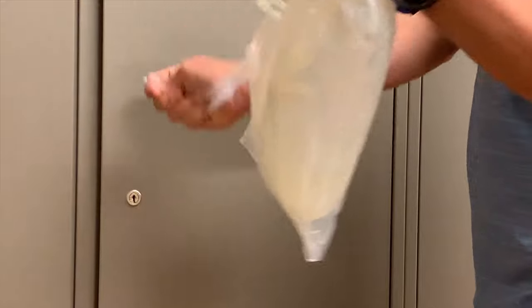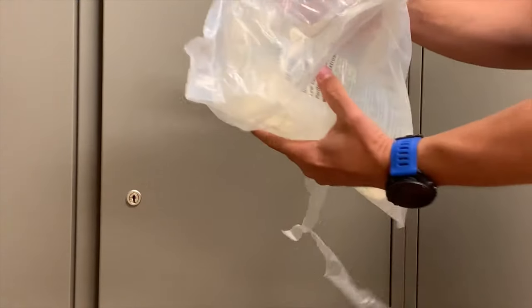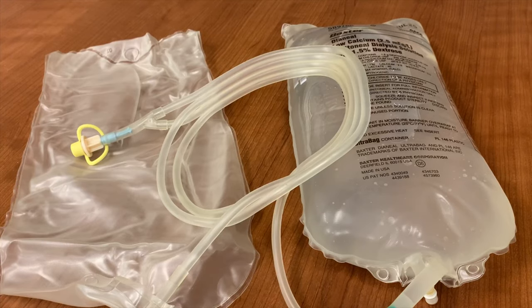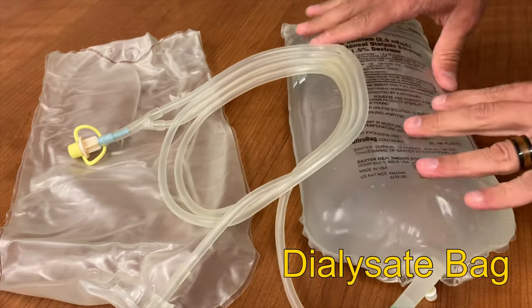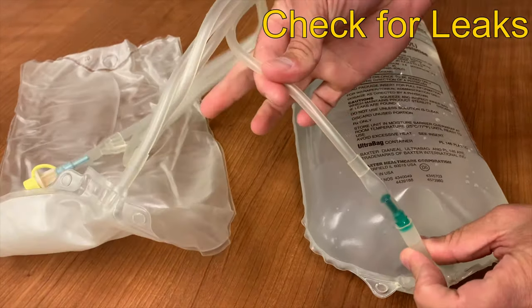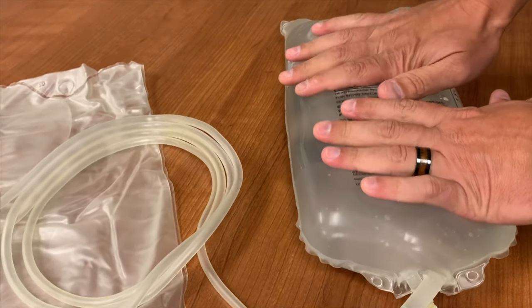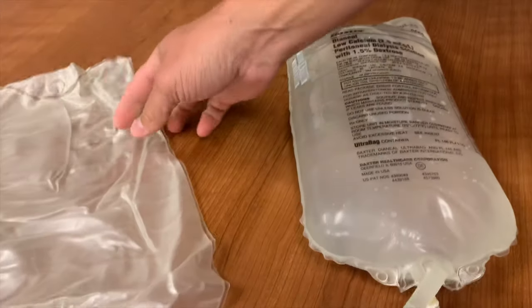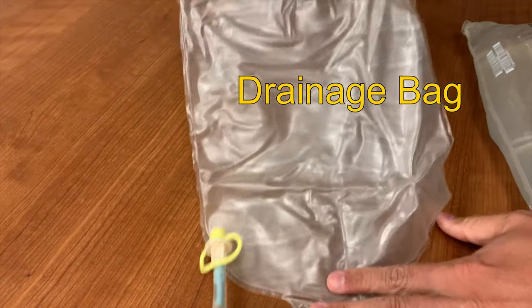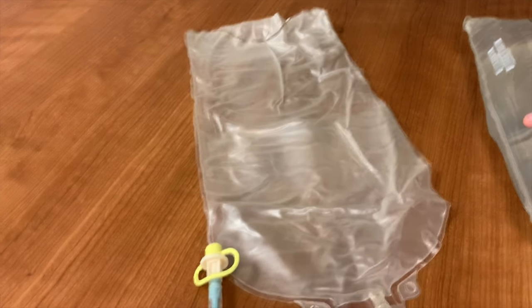Now you can open the UltraBag system. You'll notice that it includes more than just the bag of dialysate — there's also a drainage bag, and all of the tubing is already attached. Now we need to inspect the integrity of the system. Begin with the dialysate bag: squeeze it and check for any leaks. Look in the tubing to make sure that no fluid has entered the tubing, and check around the outside of the bag for any leaking fluid. Now check the empty bag, known as the drainage bag. There should be no fluid inside of this bag. You'll also notice that there's a shiny side and a matte side — this will be important later.